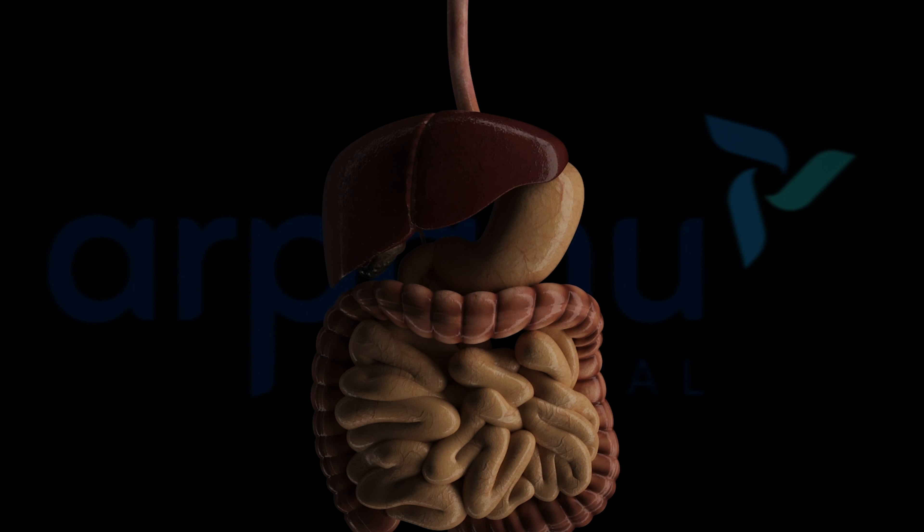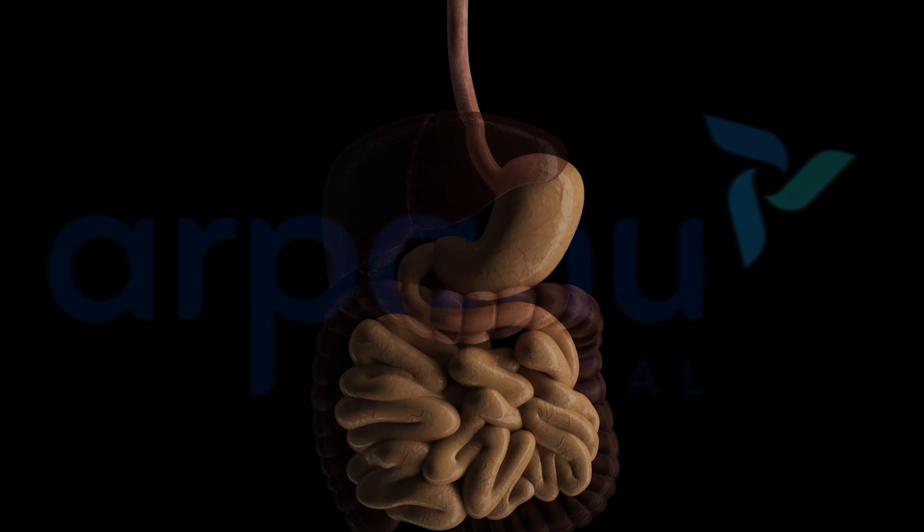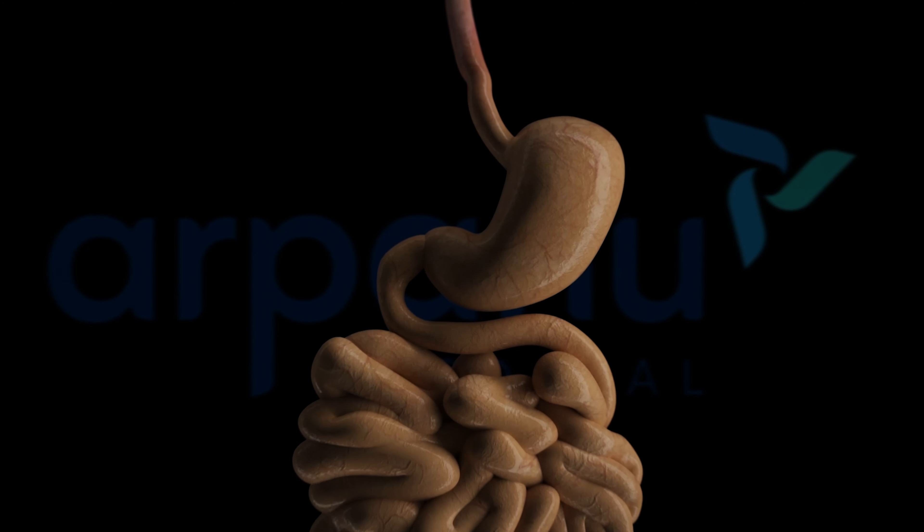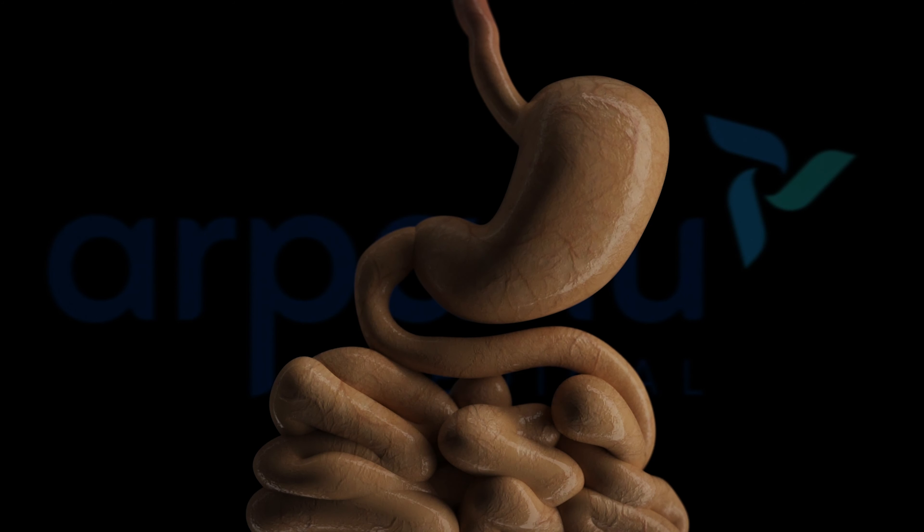For the gastric sleeve procedure, the surgeon creates four to six small incisions on the abdomen. Through these incisions, he places the trocars that will be used as a passageway for medical instruments.